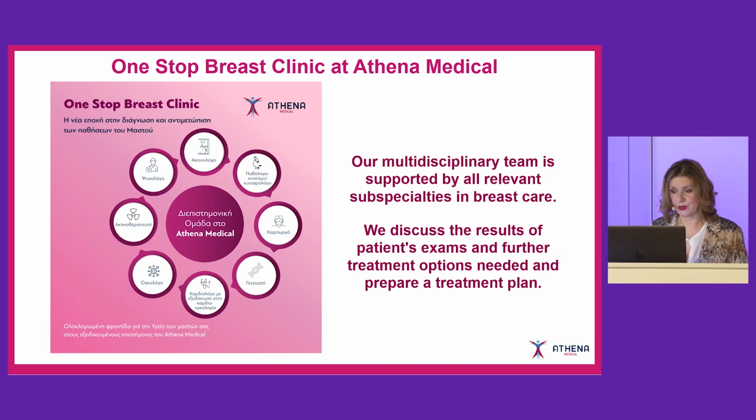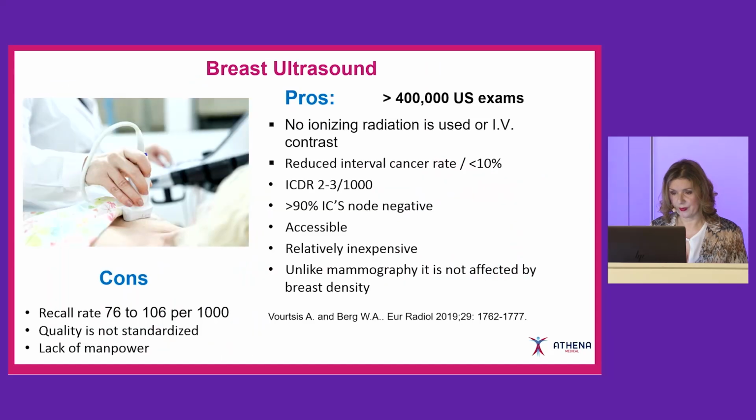So we discuss the results of patient exams and further treatment options that are needed, and therefore we give the correct suggestion and recommendation to the patient about the treatment plan that is needed.